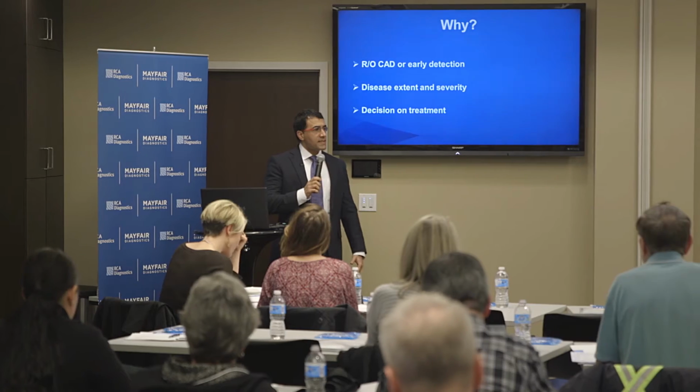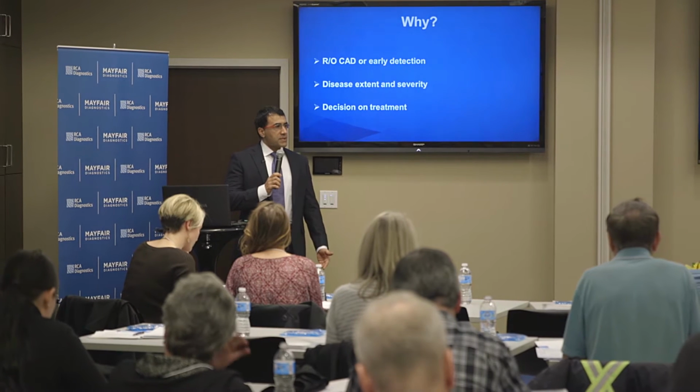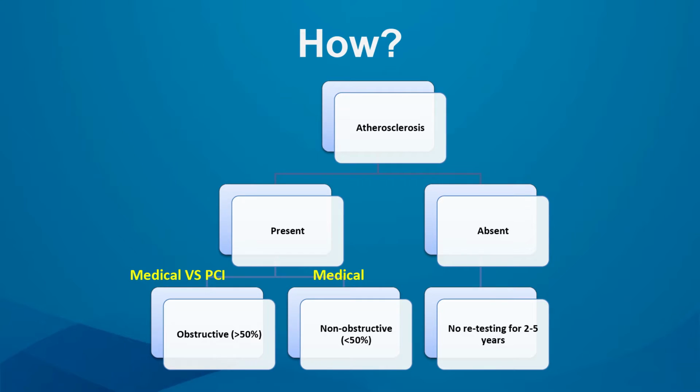We are basically looking at the whole coronary anatomy, so we can determine the extent of the disease and how severe the disease is, and it allows us to decide on the treatment options that we have for the patient. How does it help us?